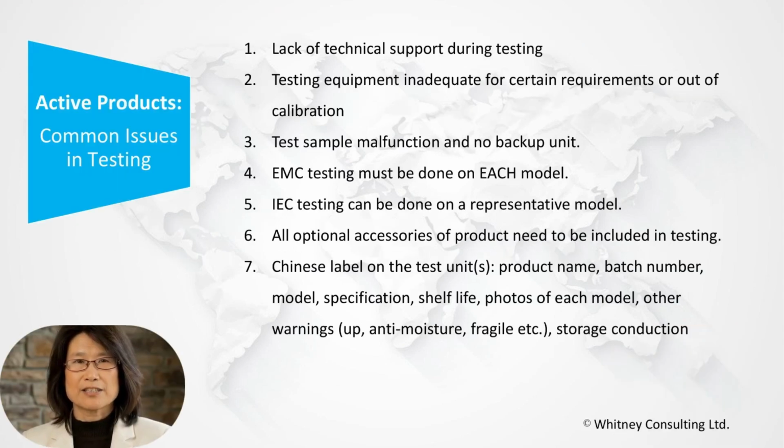In this and the next slide, I'm going to mention some challenges in managing NMPA testing. For active devices, as in any testing, technical support should always be front and center. It should be available all the time. So when a test unit malfunctions or test methods are not clear, someone can step in and resolve the problem quickly.